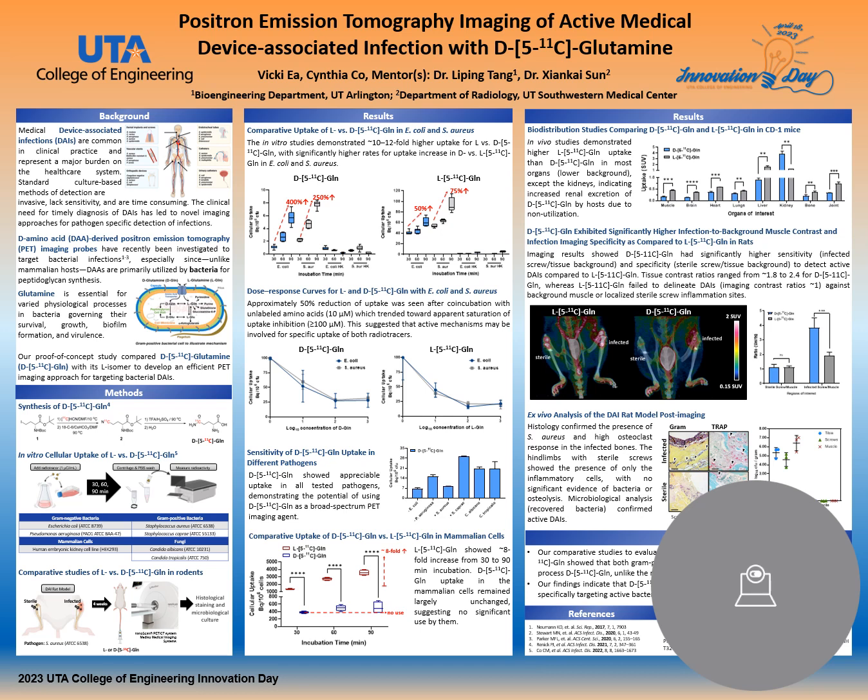Surgical implants such as dental implants, vascular stents, catheters, and orthopedic devices often result in infections that put a major burden on the healthcare system. Ideally, we would detect the infections early on rather than waiting for symptoms to arise. However, the typical detection methods in the clinic are invasive, lacking in sensitivity, and time-consuming. Therefore, the field has been developing novel imaging approaches to detecting pathogen-specific infections.